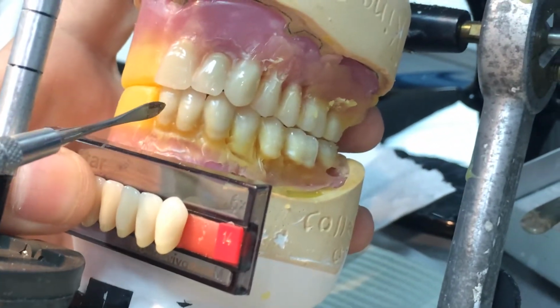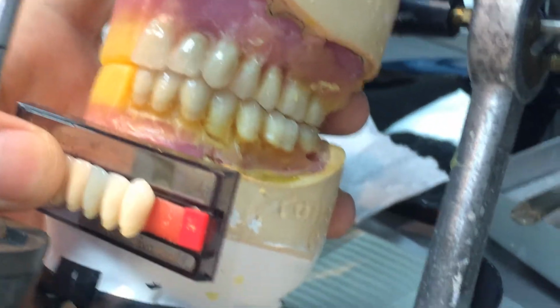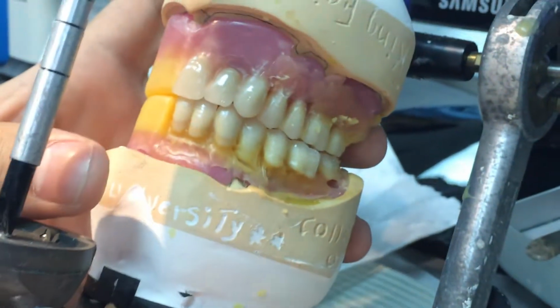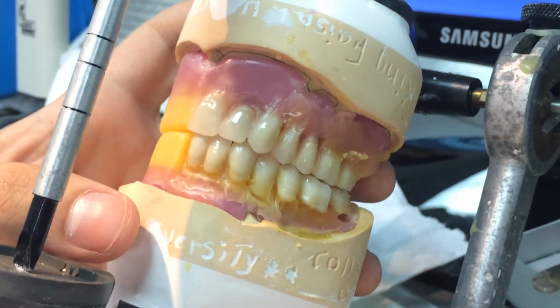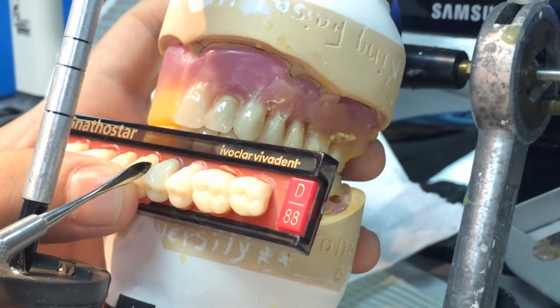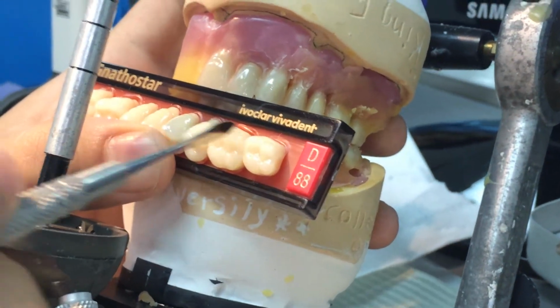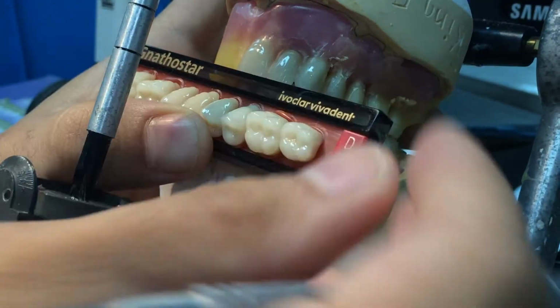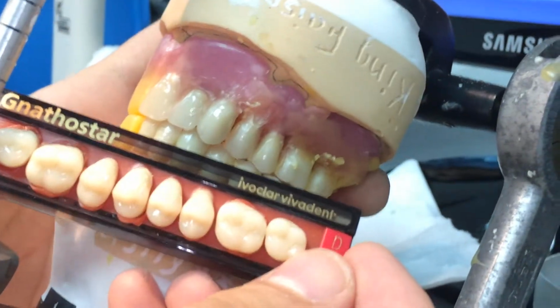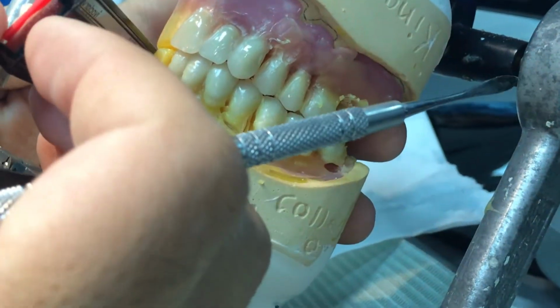Also for the lower anterior, this side is going to be here: lateral, canine, on the same side of the teeth set. Posterior teeth, I'll divide them by two, right and left. So this side is going to be here up, there, and the other side is going to be there.